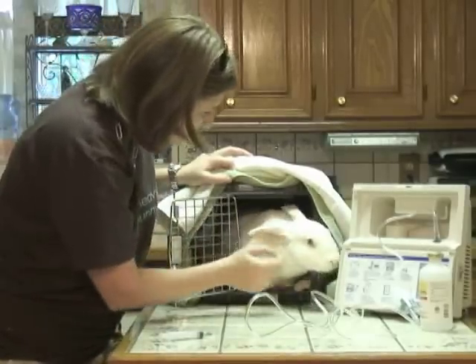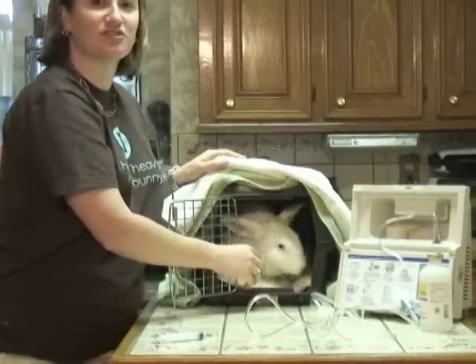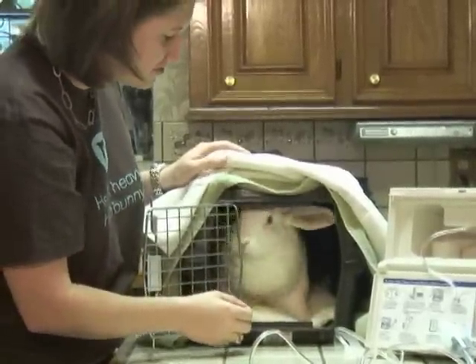She's a good girl. It's a pretty quick and painless process — a pretty easy alternative if your bunny isn't going to tolerate having a mask held up to their face. This is also a good solution.